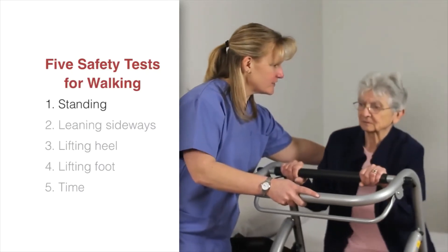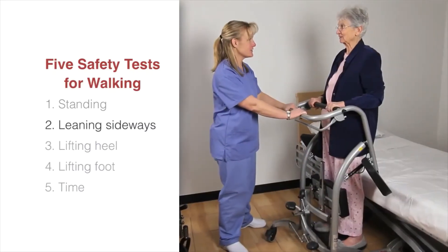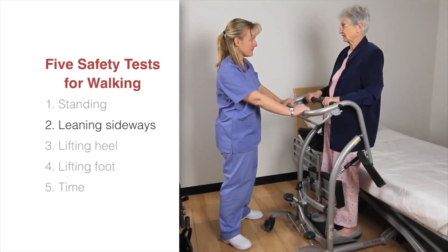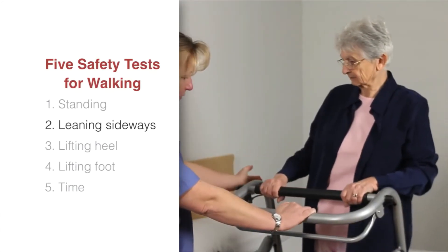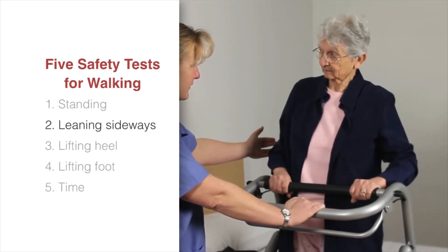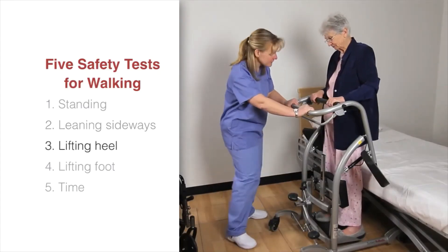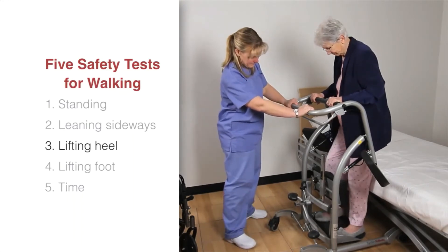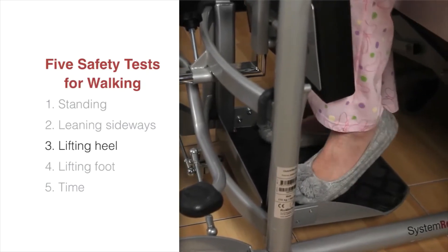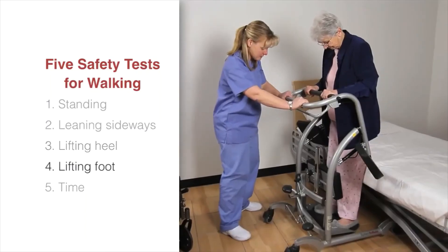Ask the patient to pull themselves up to a standing position. If they are able to, move on to the next test. When walking, you naturally lean from side to side to move your feet — the leaning side-to-side test verifies the patient's capability to perform this task. Ask the patient to lean from side to side. If this is okay, proceed to the next test. While walking we also lift the heel while taking a step — ask the patient to lift their heels left, right, left.